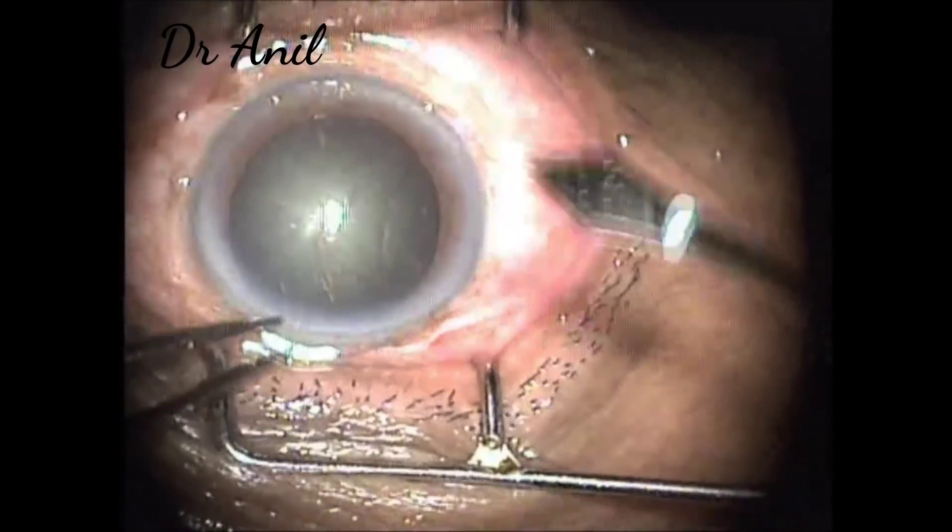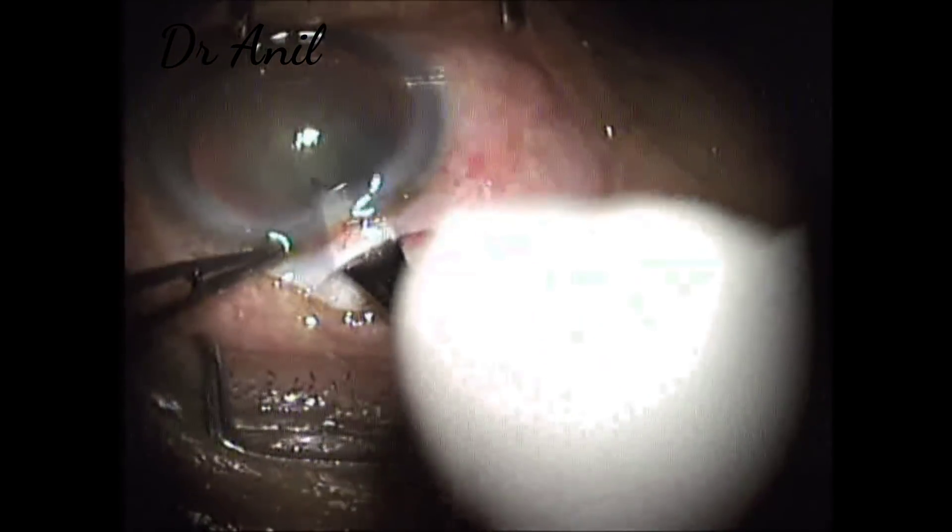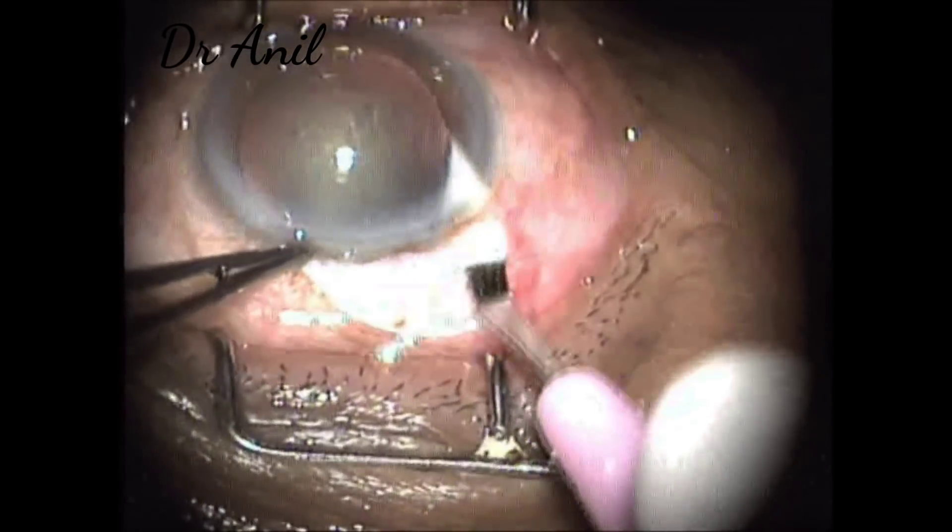Now on the right side, I just go on the right side. The entry is made by the 2.8 blade. So this is the easiest way to form a tunnel.